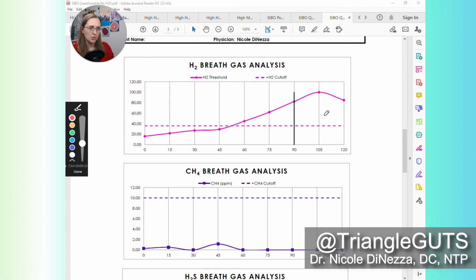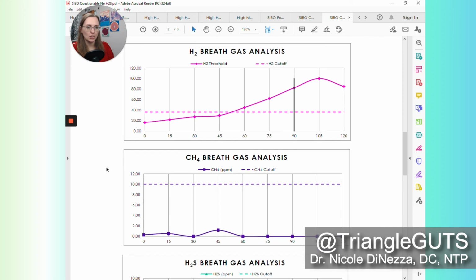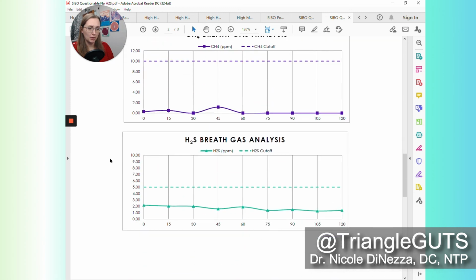But with lactulose, I'm assuming that the majority of this is coming from the colon. It would probably be prudent, and I would treat this person as though they have SIBO, but I would let them know that this is not a case where I think that antibiotics are necessary. I think we probably just need to ensure that they have really good motility and a really healthy, happy microbiome and a really diverse diet. And then maybe we'll do some antimicrobial herbs, but I'm not going to pound the snot out of them with antimicrobial herbs, because I don't think it's necessary.